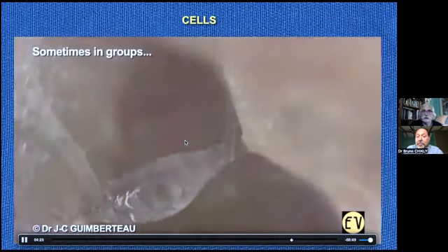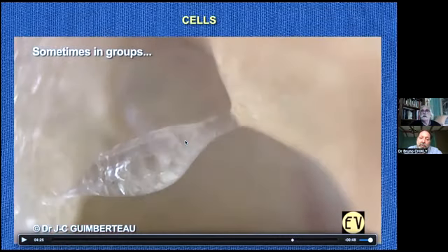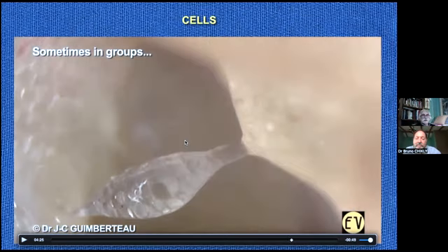We were looking for lymphatic vessels together, and they look like this. We don't know if it's really a fiber or a vessel. We're never sure. Or it could be a nerve. At this point, you couldn't say the difference, could you? Those fibers are a little bit more whitish, milky. You are sure they are fibers.